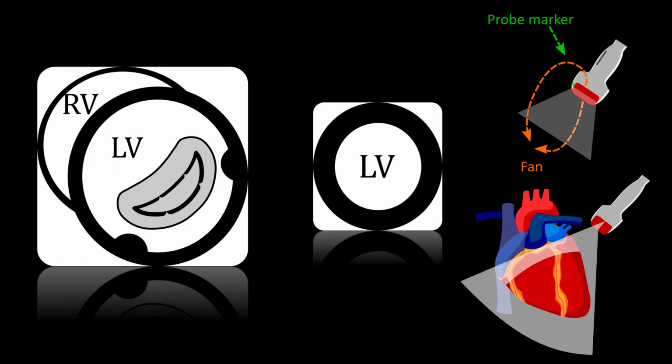The first is the parasternal short axis at the mitral valve level. This is helpful for observing the anatomy of the mitral valve, particularly in mitral stenosis, where one can trace the area if using 3D guidance. One word of caution. In this view, the septal wall may look hypokinetic. This is because this is the start of the aortomitral curtain, formed mostly of fibrous material.